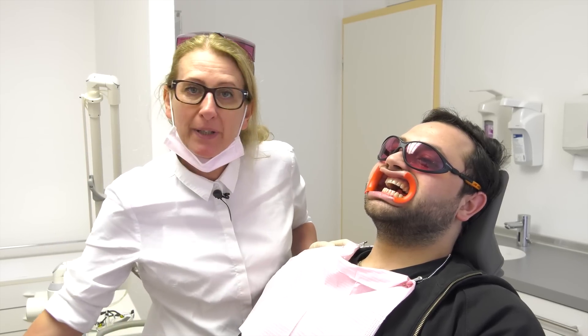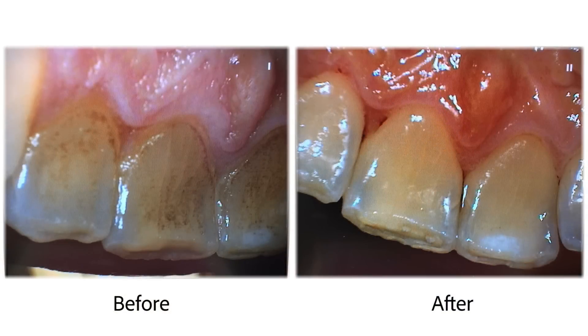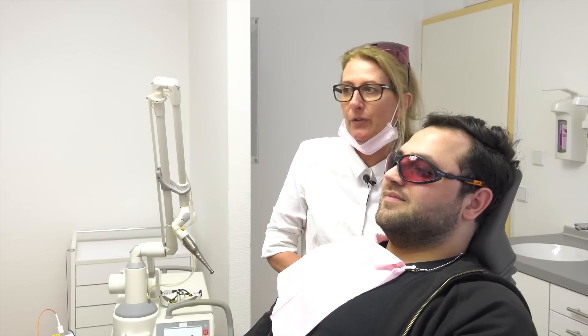I would like to take a picture so you are able to compare before and after the treatment. Now the two pictures before and after: before, you can see the discoloration and the tartar on the tooth surface. After the treatment, you can see the sealed, cleaned and polished tooth surface.